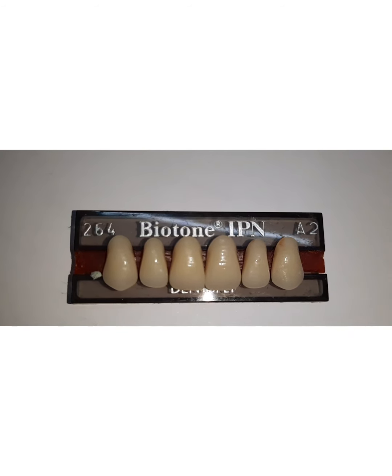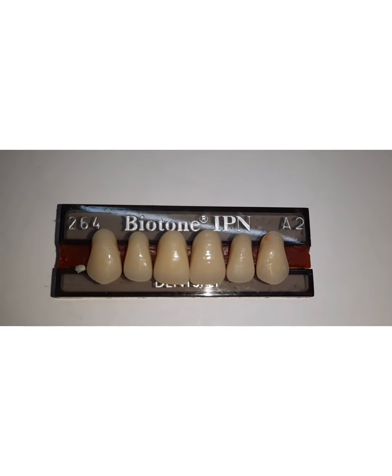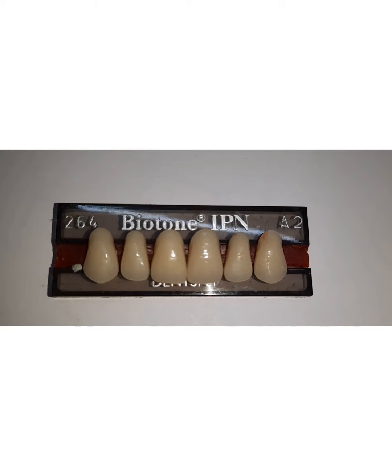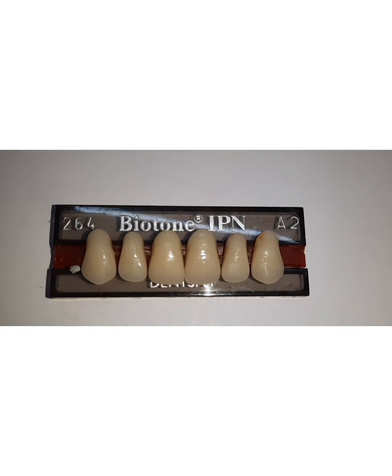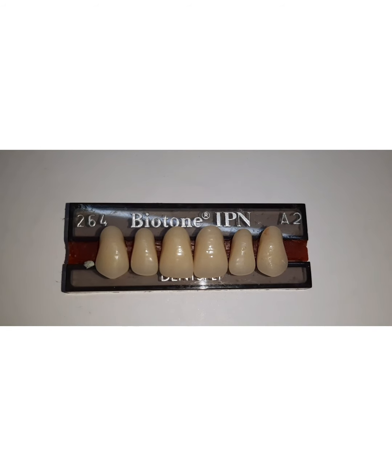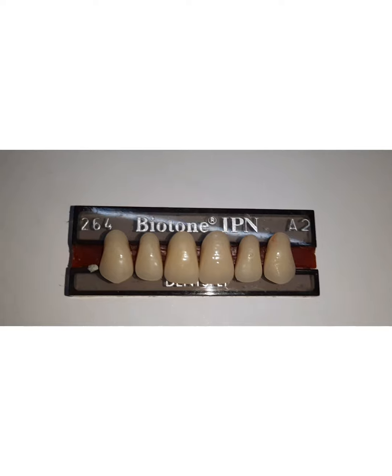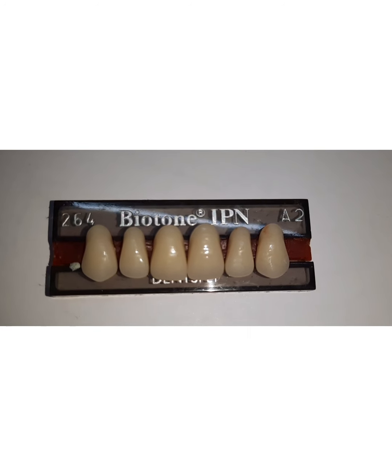However, they have a number of drawbacks. They have low wear resistance. The chances of loss of vertical dimension because of this are high, and the teeth cannot be rebased as such. They tend to stain. That is another drawback of acrylic teeth, and also shape and form cannot be maintained on trimming.